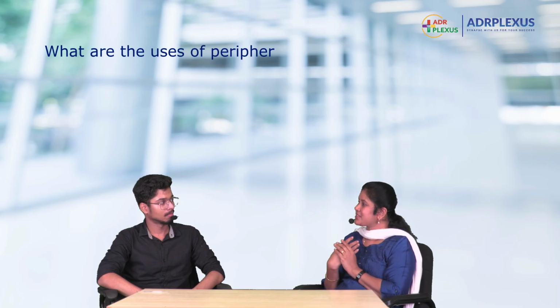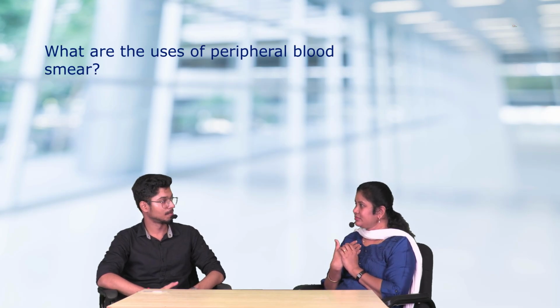What are the uses of peripheral blood smear? It's used to study the morphology of the cells, that is RBCs, WBCs, and platelets, and to detect any parasites that are present, like trophozoite forms in malaria and filarial parasites. It serves as a permanent record. We could also determine the sex based on the Barr body present on the nucleus of the neutrophils. As a permanent record, it can be used as a prognostic factor for the disease or to assess the response to treatment. So it is a very useful tool in diagnosis.